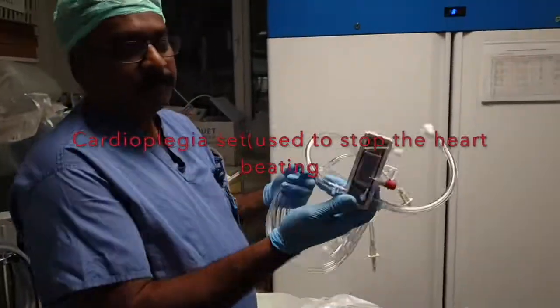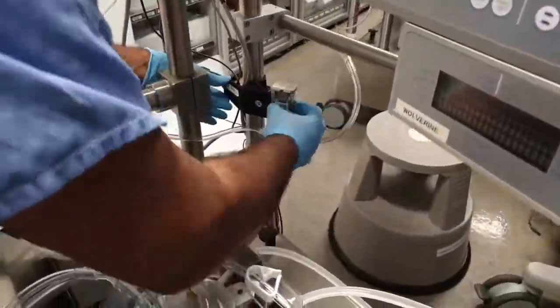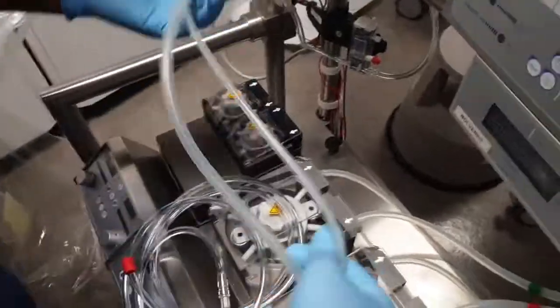This is the Cardioplegia delivery system. A solution is mixed with blood and pumped directly into the heart to stop it.